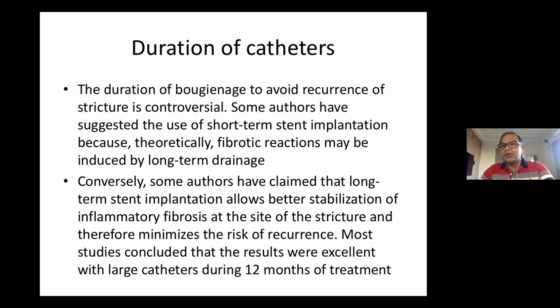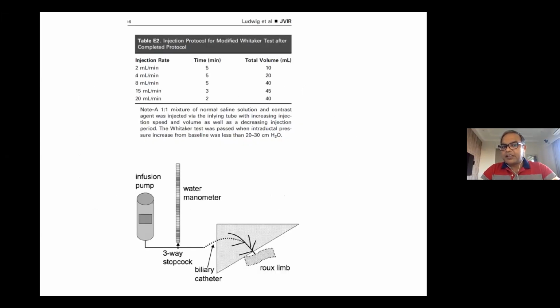Yeah, again, as I told you, regarding the duration of catheters, the 12 months, the data is there that if you place it for long term, the data is good. Now coming to a very important topic, the biliary manometry.